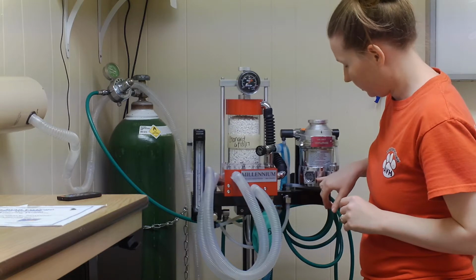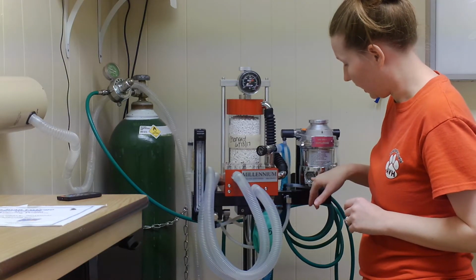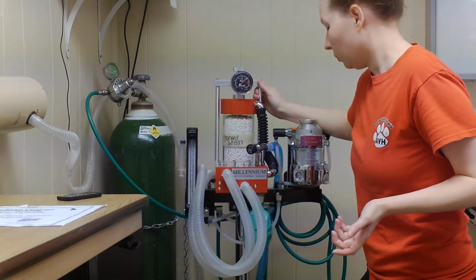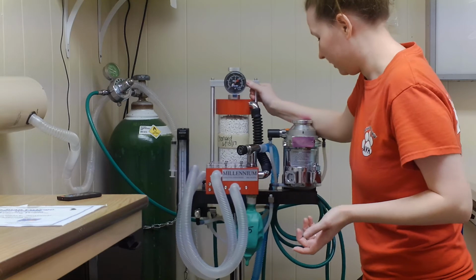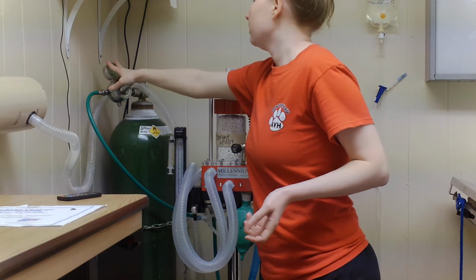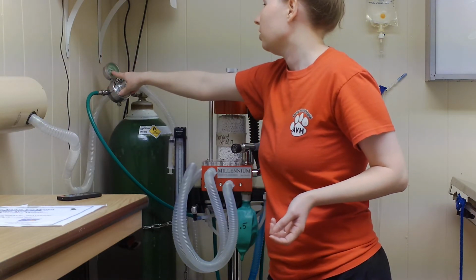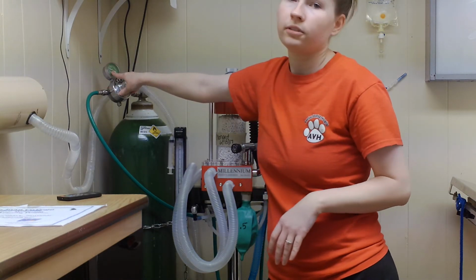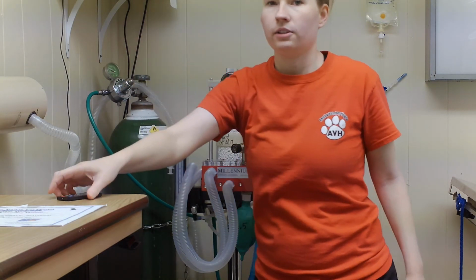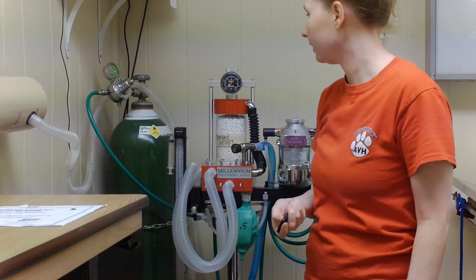And then always check your gas to make sure that you have plenty of gas in here. The last thing you want to see is your patient waking up during surgery because you don't have enough gas in your vaporizer. And always double check your oxygen tank to make sure that you have plenty of oxygen for your patient. But that would be it. That's how you prepare an anesthetic machine and make sure that it's not leaking or anything like that.